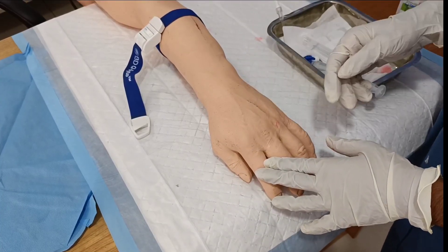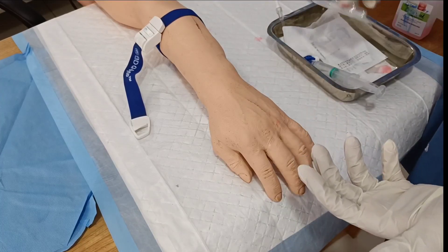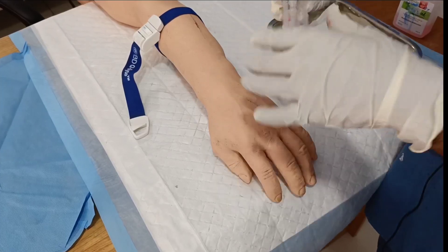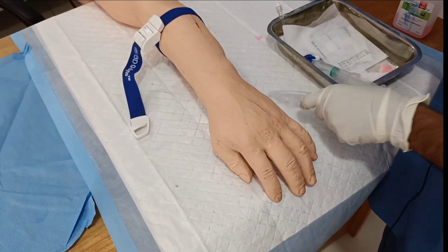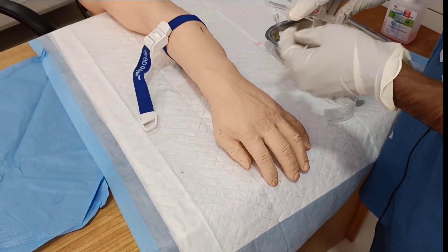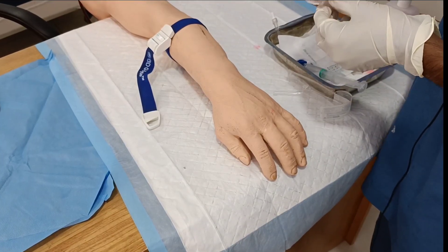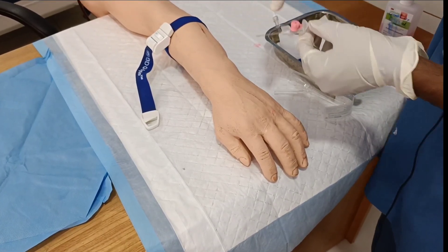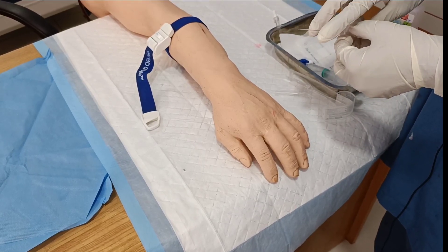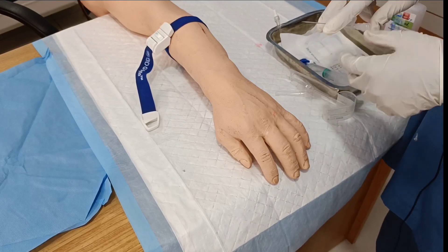After choosing the vein, open the cannula and ensure the site is flat. Remove the cap. Make sure that after opening the cannula, your fingers should not touch the catheter, as this is prone to bacterial contamination.